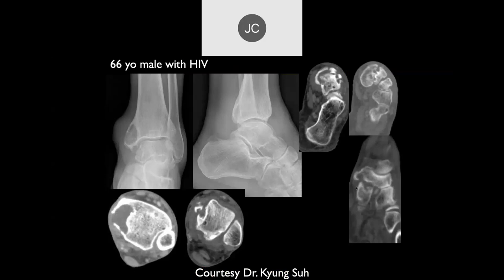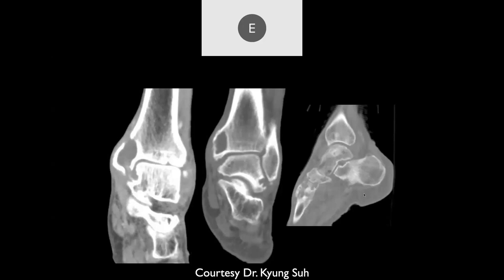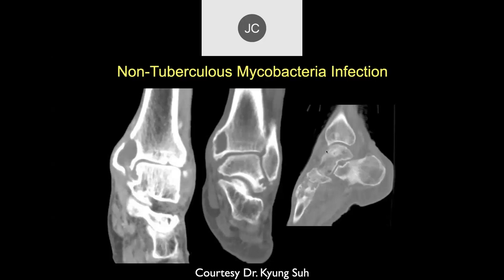A 66-year-old with HIV. Radiographs and CT show lucency in the medial malleolus, bony destruction of the midfoot bones and joint spaces, and focal lucencies in the bones throughout — not as painful as you would expect. This was another case of atypical mycobacterial infection.